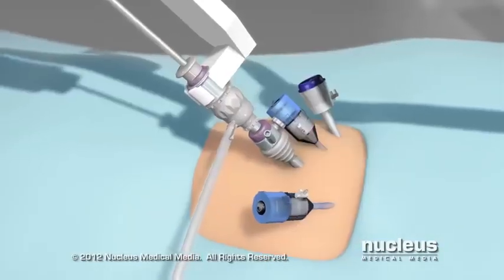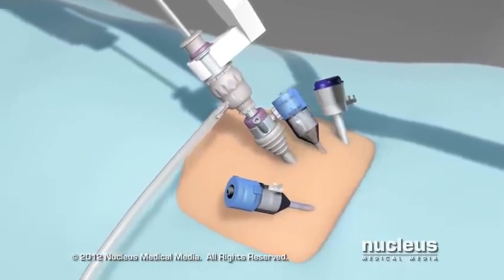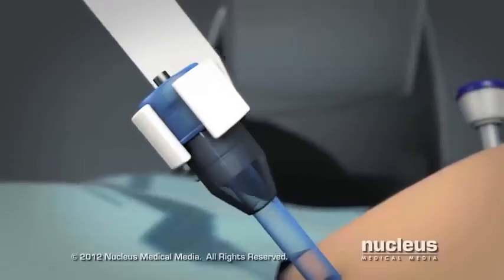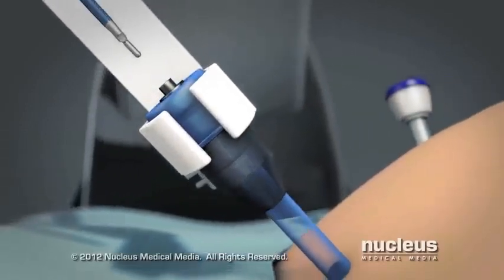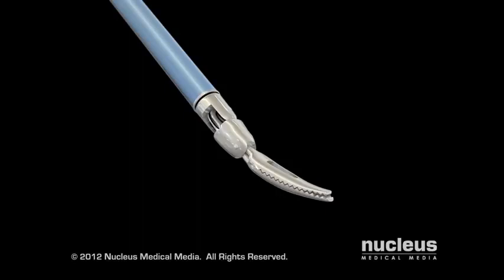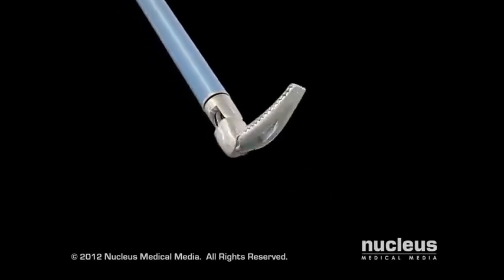Your surgeon will make additional port incisions for robotic instruments as well as instruments used by patient-side assistants. An assistant will insert all of the robotic tools through these ports. Unlike standard laparoscopic instruments, these tools can rotate 360 degrees and have more flexibility than the human wrist.